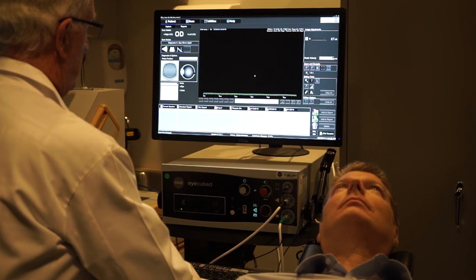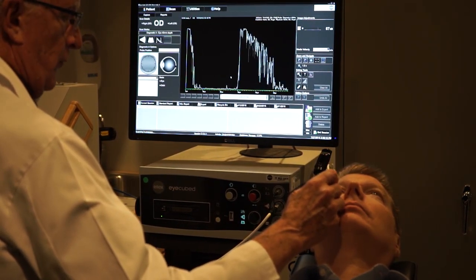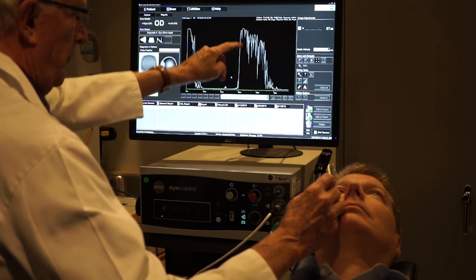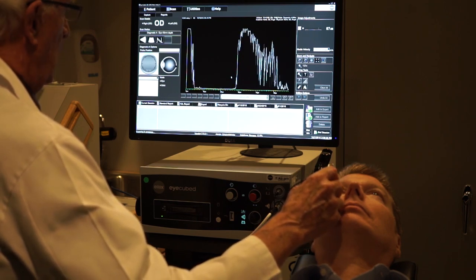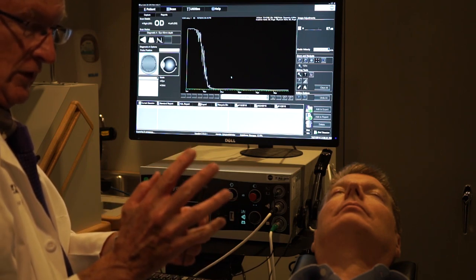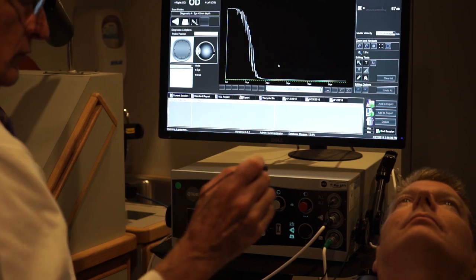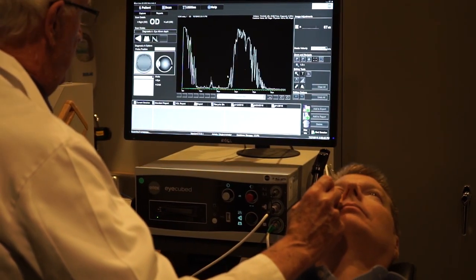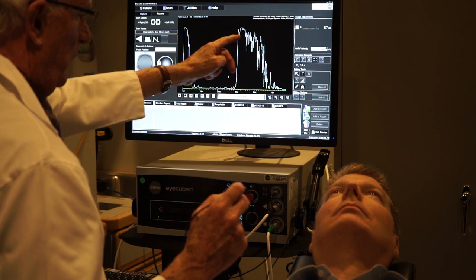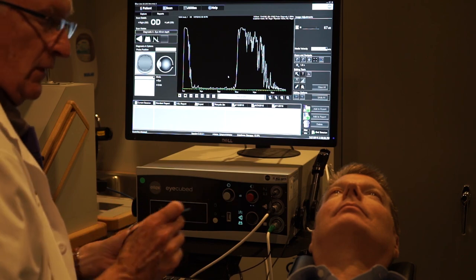On the machine, this is going to show a bunch of vertical lines dancing around. I'm in the same positions — I'm putting the probe here and aiming towards the posterior fundus, going through the vitreous. This is the superior fundus here, and I just scan back and forth. There's no mark on this probe, unlike the B-Scan probe, because there's no transducer inside going back and forth — it's just a sound beam, so the orientation doesn't matter. As I aim towards the superior fundus, I look for any irregularities: going through the vitreous, here's the retina, here's the orbit. By experience I know what I'm looking for, but beginners have a hard time with this concept.